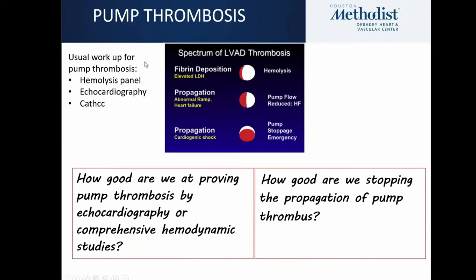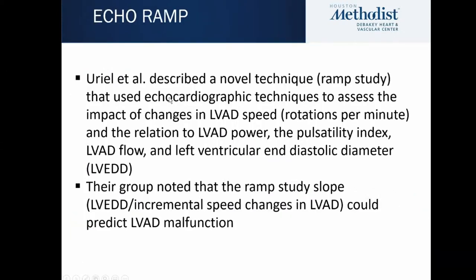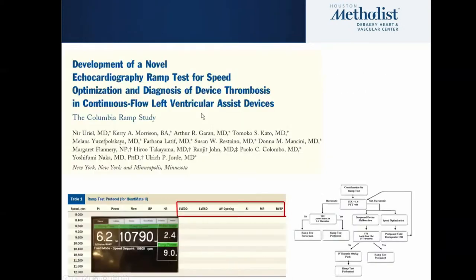The good news is that the rate of pump thrombosis has been decreasing, yet with HVAD still, we do have pump thrombosis, and it's important to make this diagnosis. Usual workup includes hemolysis panel in addition to echo, and you can use cath. What was done in the last 10 years is that a novel technique, or the RAMP study, was used to then assess if the LVAD is unloading effectively or not. In essence, if your LVAD doesn't unload effectively, that tells you that the device is malfunctioning.